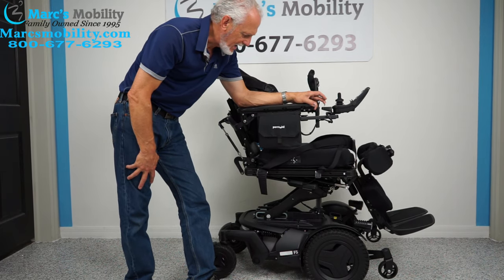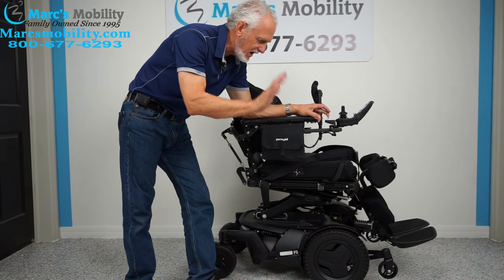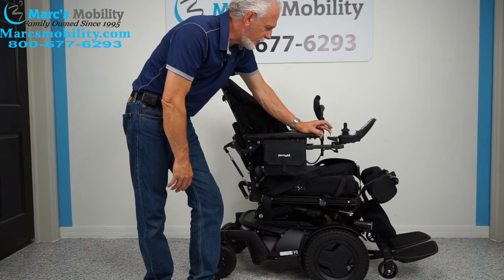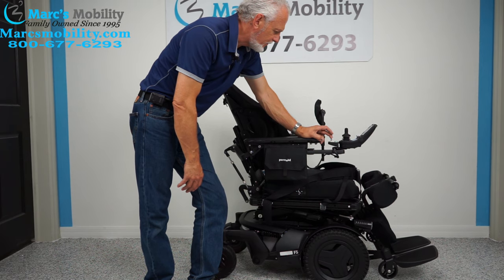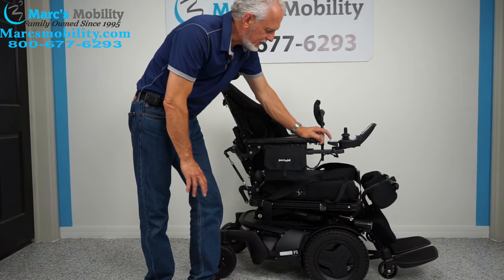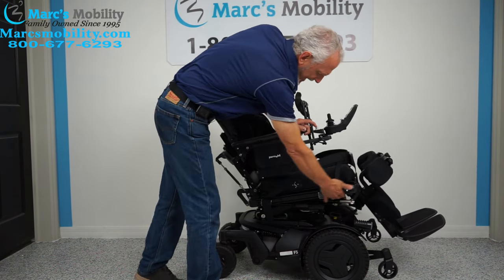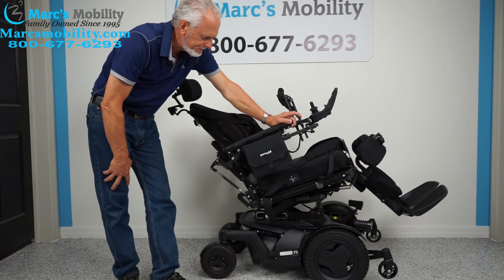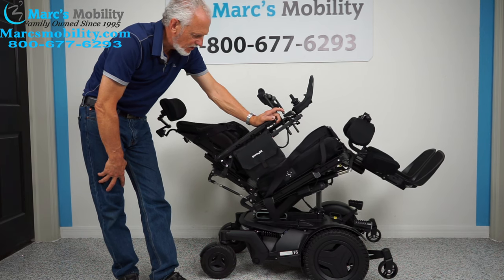The standing feature and the seat lift are the two major functions people ask about — very important to a lot of people. Another great feature is the electric tilt. The electric tilt is when the base goes back, taking the legs and the back with it. Let me bring the seat all the way down first, then demonstrate the tilt — this is how far back it goes.